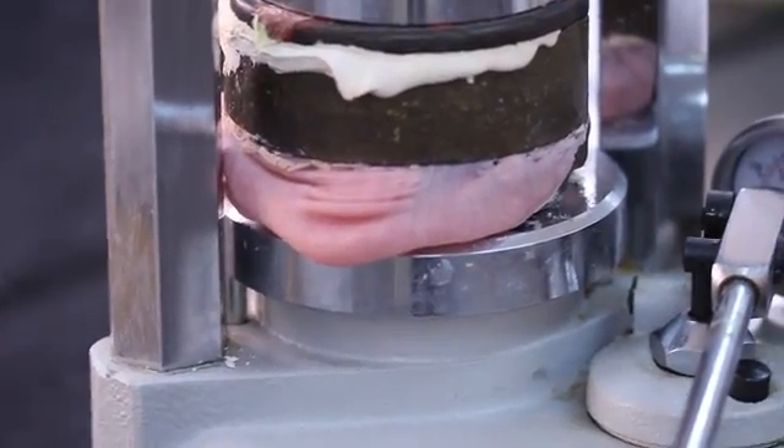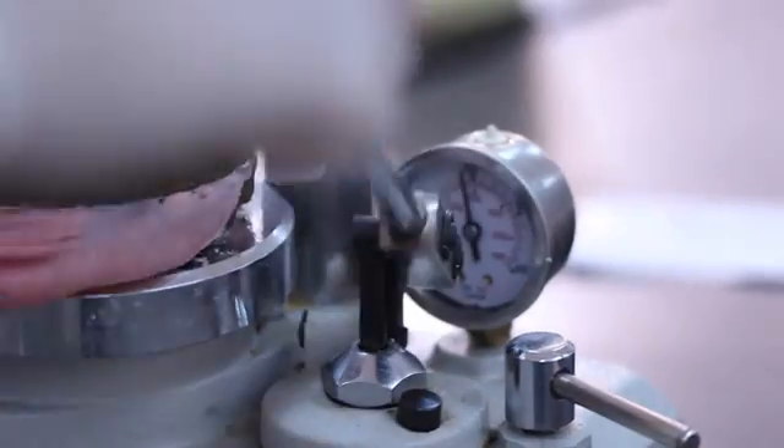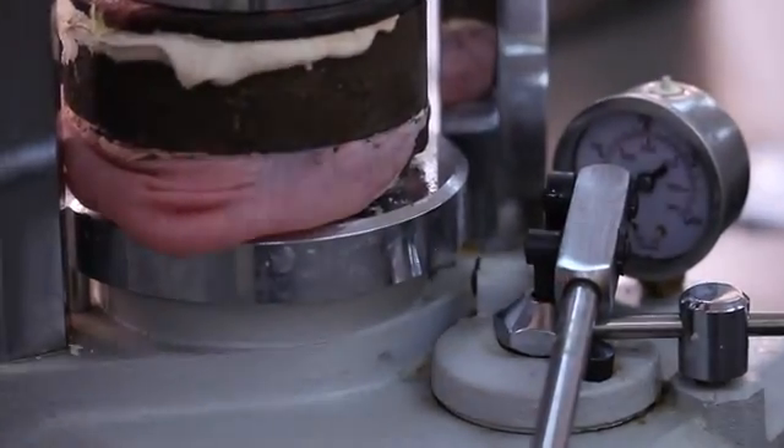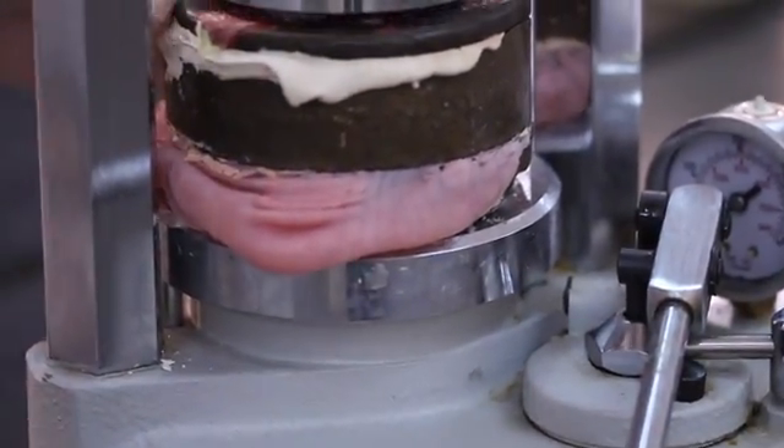The resin mixture is pressed into and around the teeth in one portion of the flask. A plastic sheet is placed between the portions of the flask and then it is closed. The flask is placed into a hydraulic press and pressure is applied. The resin is given sufficient time to flow. If sufficient resin is used, there should be flash around all margins of the denture base. If flash is not present around the margins, a small portion of resin is added to the deficient area before the next trial packing.